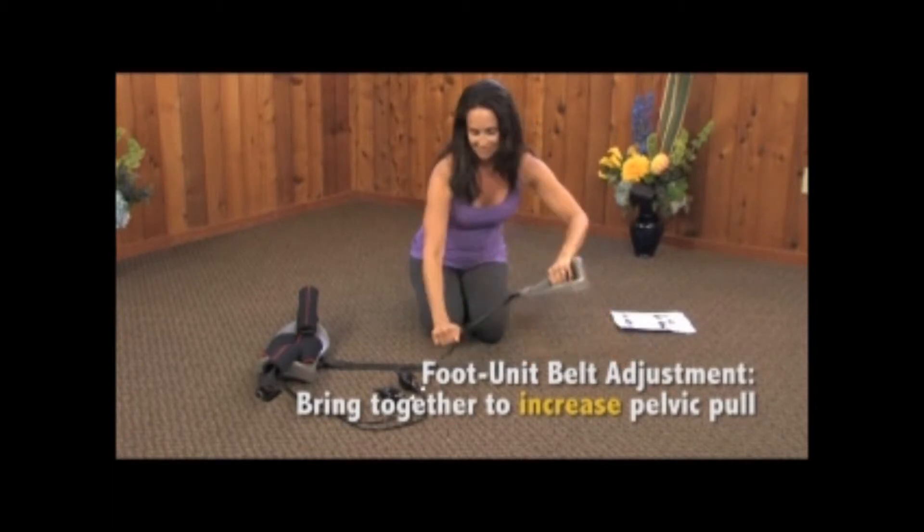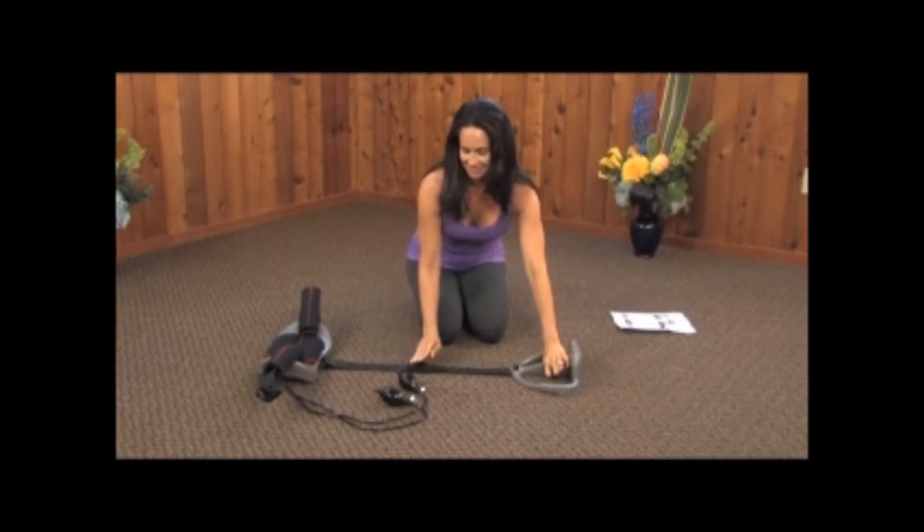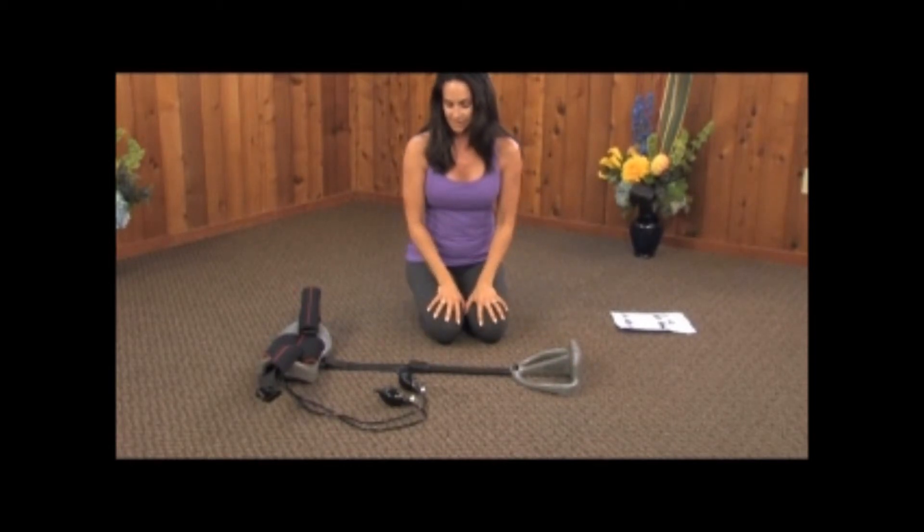To increase pull, open the buckle flap completely. Grasp the foot unit and pull or slide the buckle toward the back unit. Lock the buckle completely.